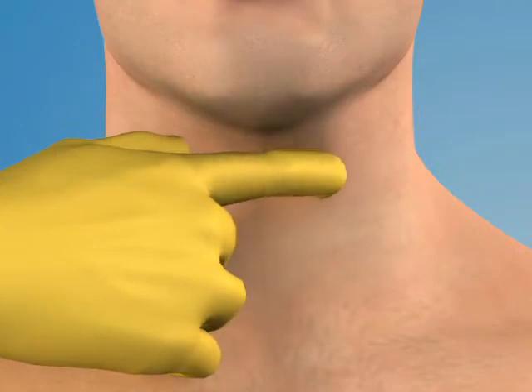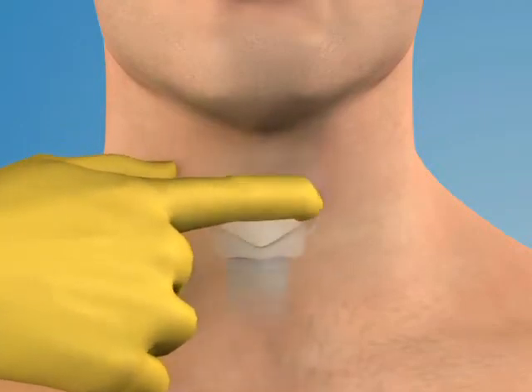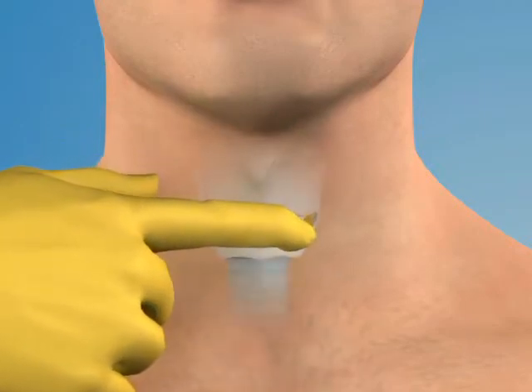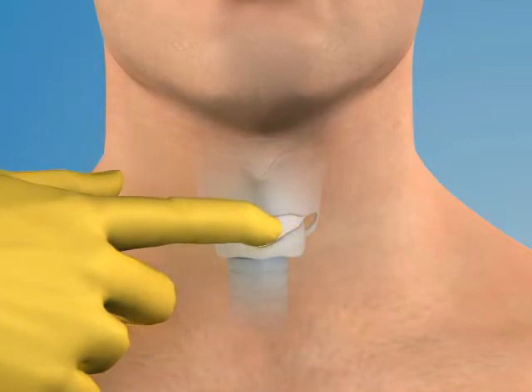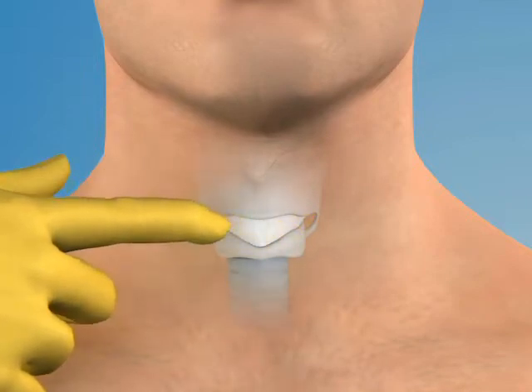To locate the cricothyroid membrane, first identify the prominent thyroid cartilage, then palpate the shallow depression just below it. The membrane measures about one centimeter longitudinally and two to three centimeters transversely.